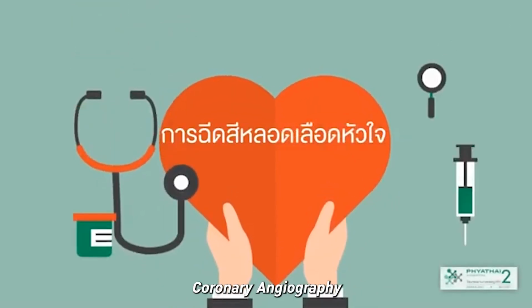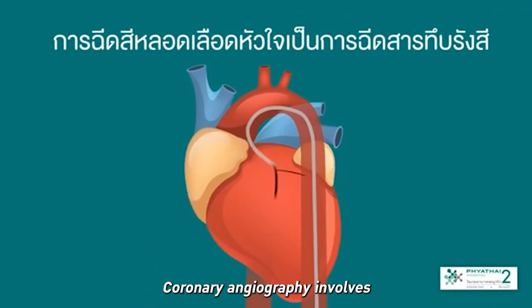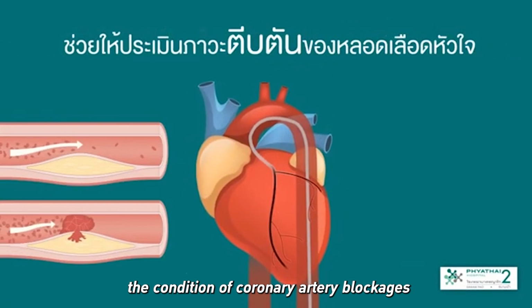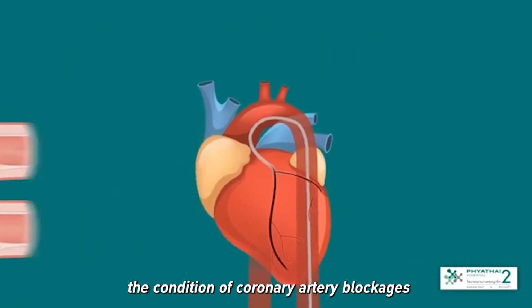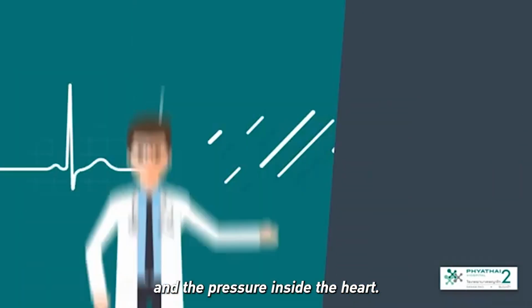Coronary angiography. Coronary angiography involves the injection of a radiopaque substance to help assess the condition of coronary artery blockages, the function of the heart valves, and the pressure inside the heart.